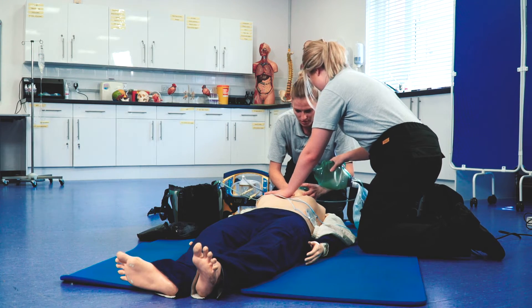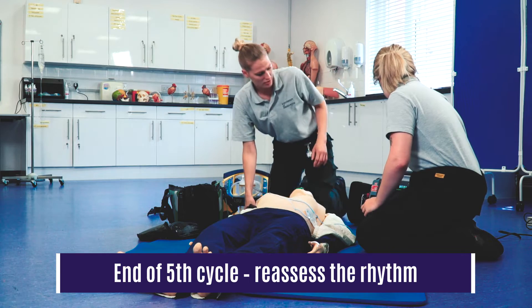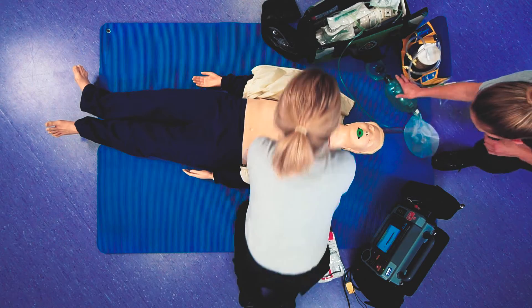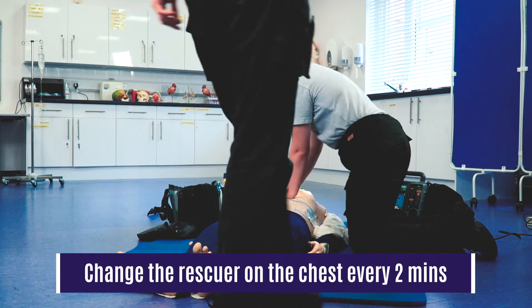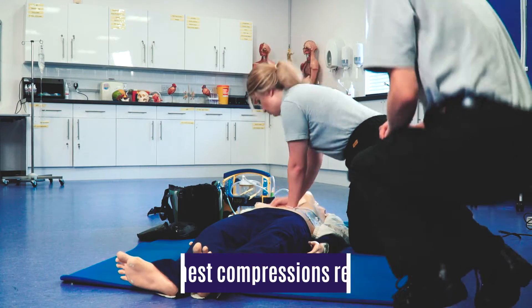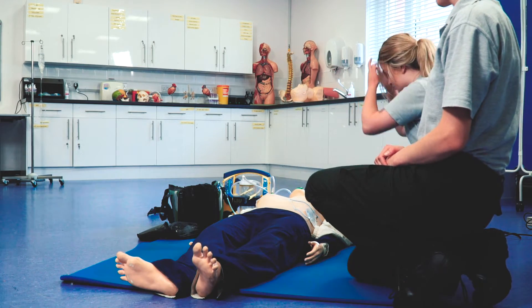Let's do a rhythm check please. So we're still in VF, so I'm going to charge. I'm going to come round so I can take over once you're done. Oxygen away. Stand clear everyone. Shocking.